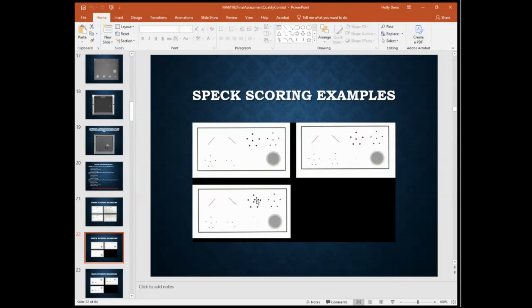Moving down to the bottom left, 1, 2, 3.5, and then you move on to this 1, 2, 3, 4, 5. This would get a full point if I had not just scored a half here, because I have to stop. So again, 1, 2, 3.5, and stop. So you wouldn't count that. So that would be 3.5. And like I say, even though I see 5 full specs on that last one, I cannot count it because I just gave a half a point.